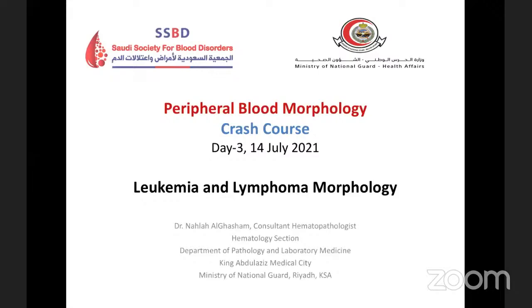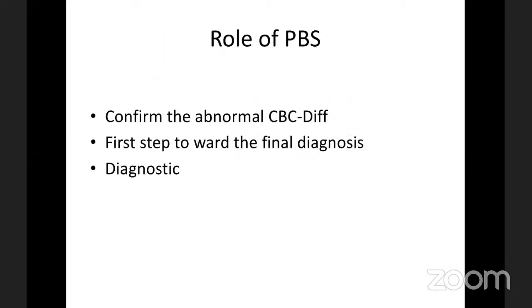My cases are arranged randomly so that you wouldn't predict what's the next case or what's the presentation. We will discuss the patient's clinical presentation, CBC findings, and then the morphology, and we'll try to go through the diagnosis. I'll try to make it interactive if time allows.